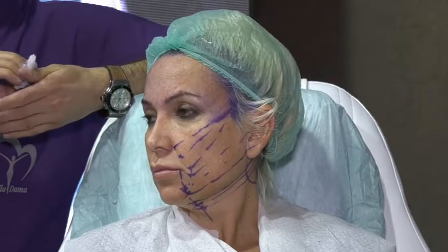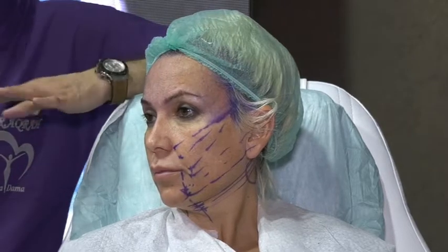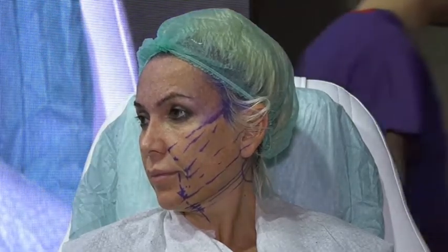The second solution: I am not able, in each patient and in each thread, to reach the maximum. If I cross the anterior border of the sternomastoid, it's even enough for me. But down, you can go more.